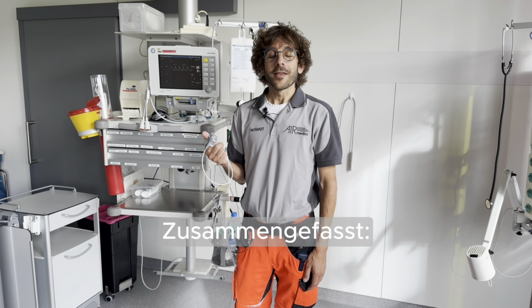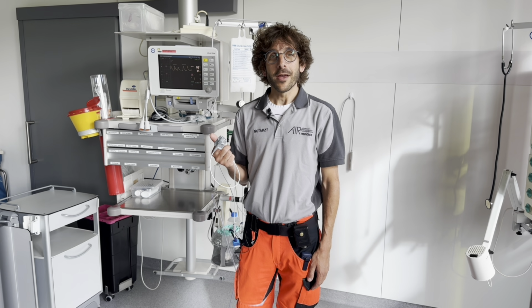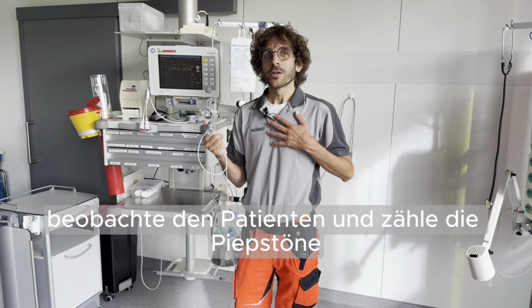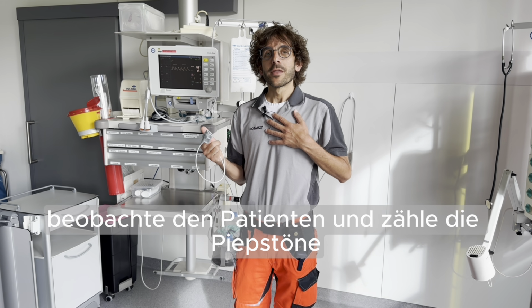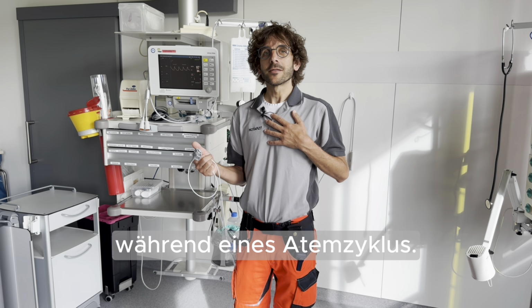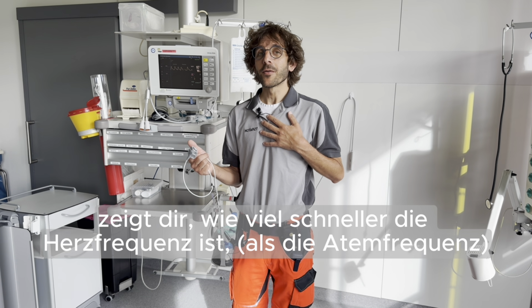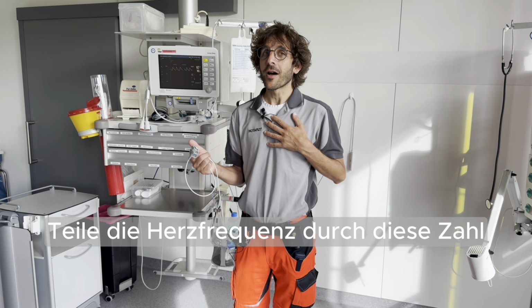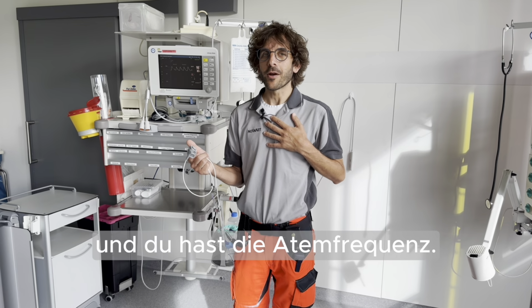So a quick summary to determine the respiratory rate: take pulse oximetry, turn on the sound, watch your patient, and count the number of blips during one respiratory cycle. That number tells you how much quicker your heart rate is. So divide your heart rate by that number and you have your respiratory rate.